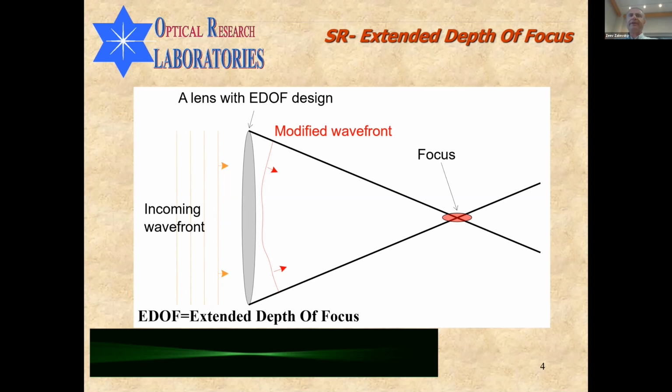Also, they have low energetic efficiency, which is also not good, especially if you try to look through those lenses during the night or in low illumination conditions. But as I said, they are flat and low cost. So this is the advantage, and therefore they could be suitable for ophthalmic devices. But again, they have low energetic efficiency and high aberrations.